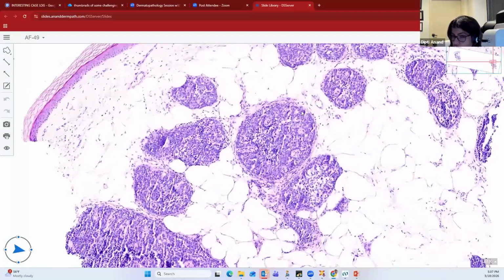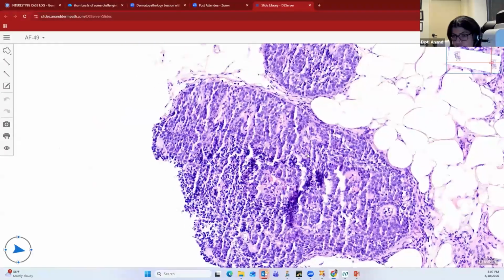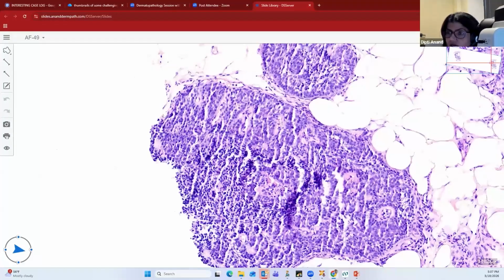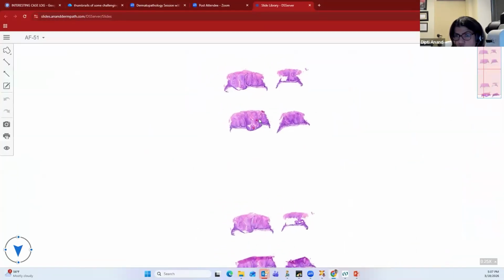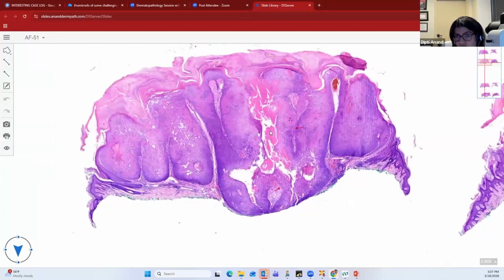So that's your adamantoid trichoblastoma or cutaneous lymphadenoma. You can see here these lymphocytes, a swarm of bees, which are attacking the follicular epithelial islands. It's uncommon. It's not common. So if you can recognize an adamantoid trichoblastoma or cutaneous lymphadenoma, you're certainly in the 95th percentile. So that's really good. The next very common board entity is an inverted follicular keratosis, or an IFK.